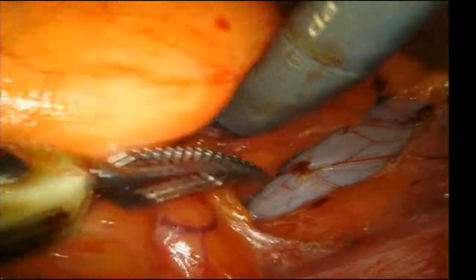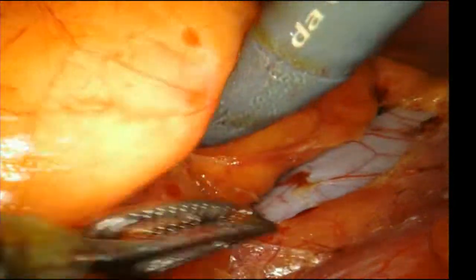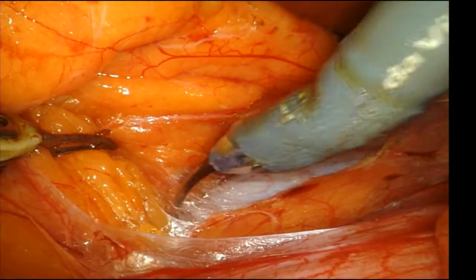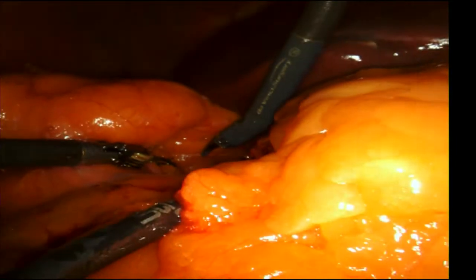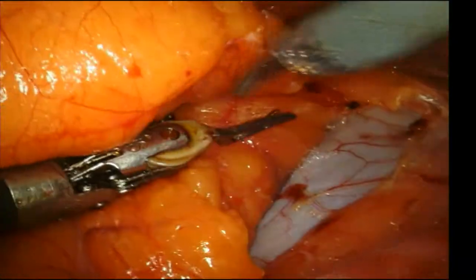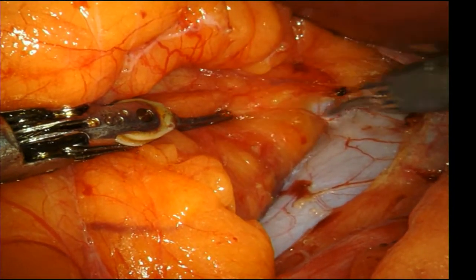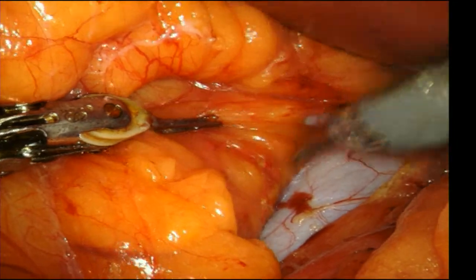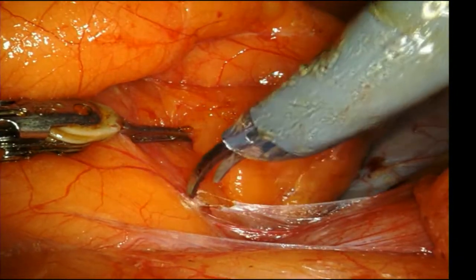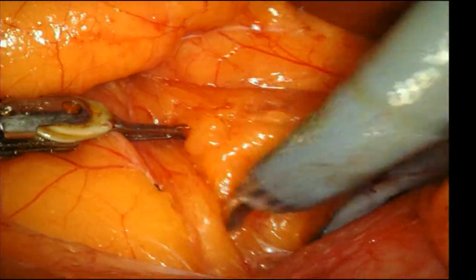I still put the camera port at the umbilicus because I want the most medial port for the camera as possible so I can get as panoramic as necessary, especially if you're flipping the kidney. If you're doing a transperitoneal and flipping the kidney, you want your camera as medial as possible, otherwise you might be looking backwards on the kidney. So I keep the camera port at the umbilicus, and then I extract at the umbilicus so I don't have to cut through any muscle, and I believe that is helpful for the patients in terms of postoperative pain.